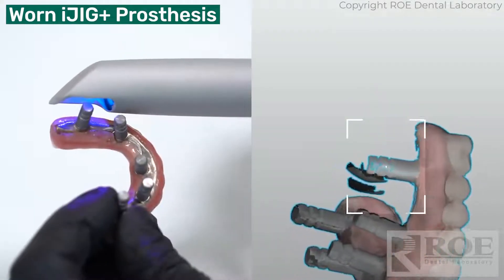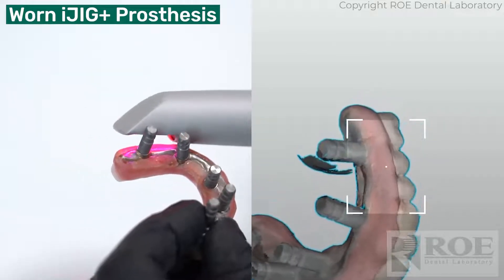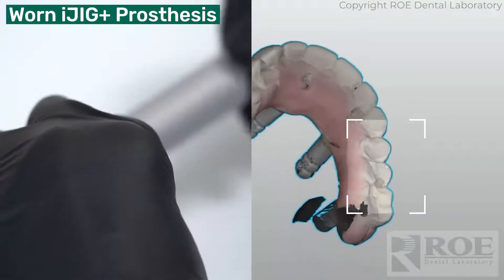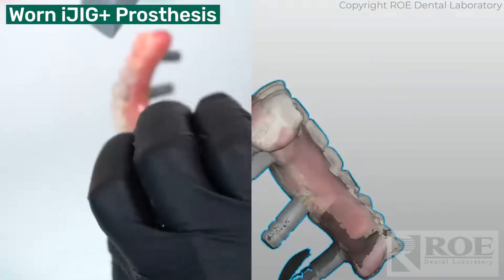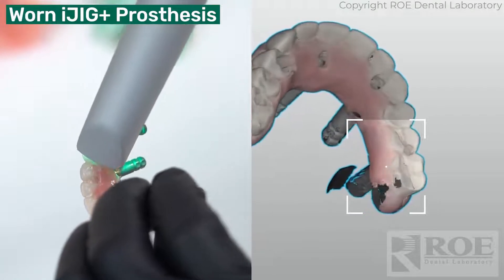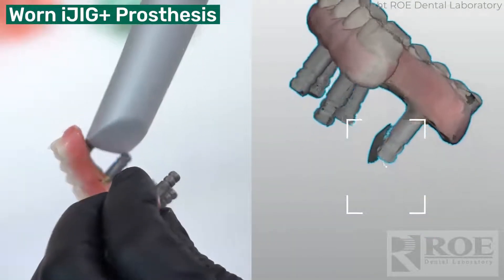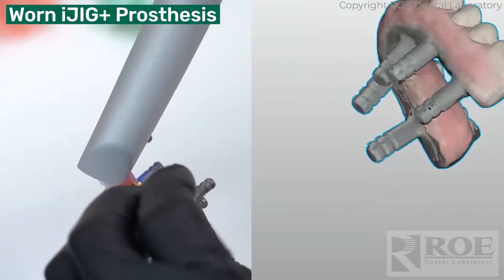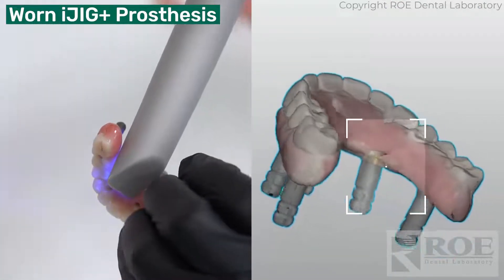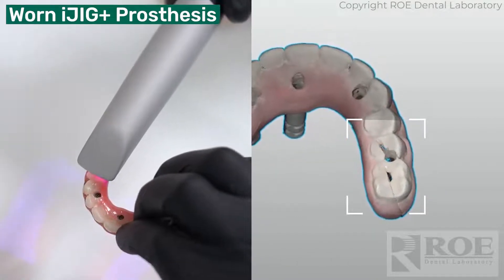There we go. It's going to remove where my glove was as I scan around that area, and will come up on the lingual too — the glove will totally disappear. You can even see this prosthetic has a big crack in it, but the doctor verified that it fit. It had a little concern with some stitching, and it reoriented and aligned itself. So there's a little break in the prosthetic right there — it was time for a new one.